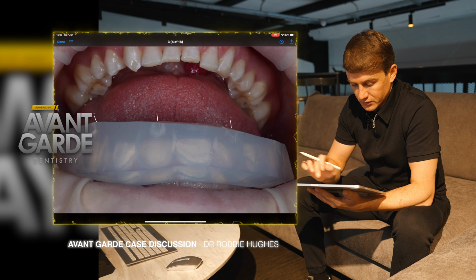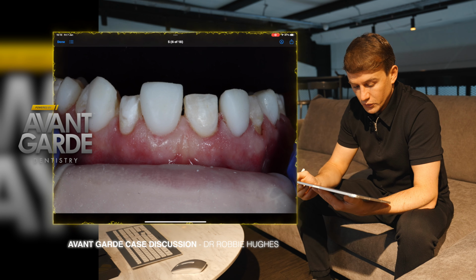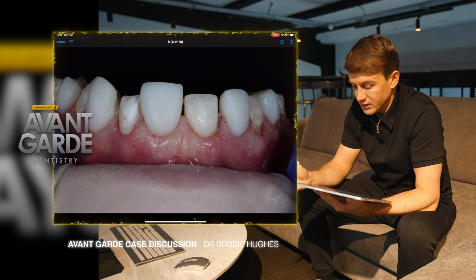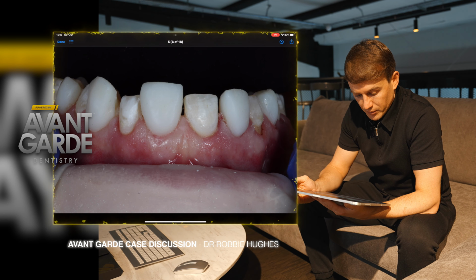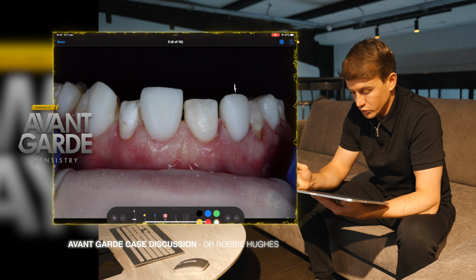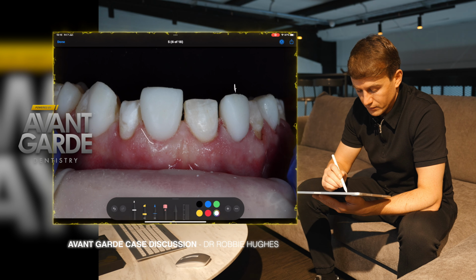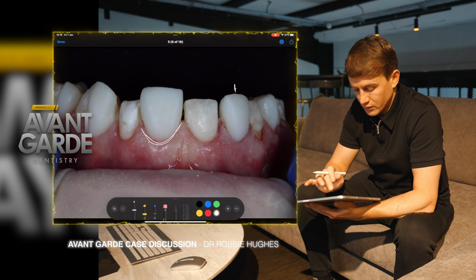Which brings us to this. Stage 1 bonding is complete. Every second tooth has been bonded, and some minor finishing, removing the sprue holes, which would be here, and some refinement and tidying up around the gums.